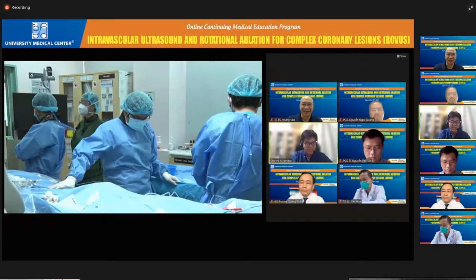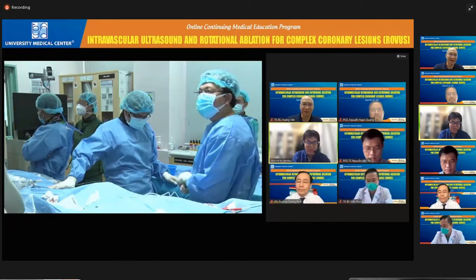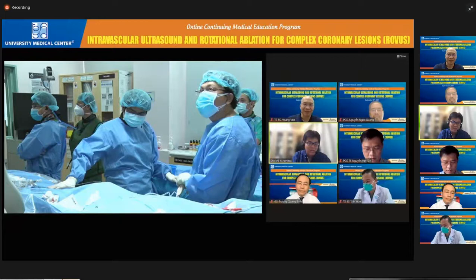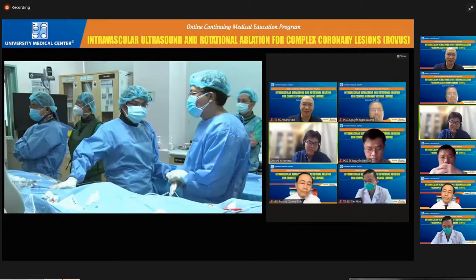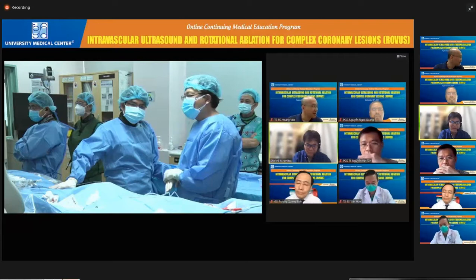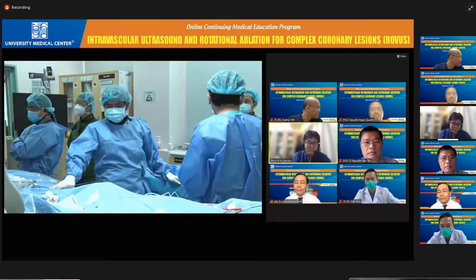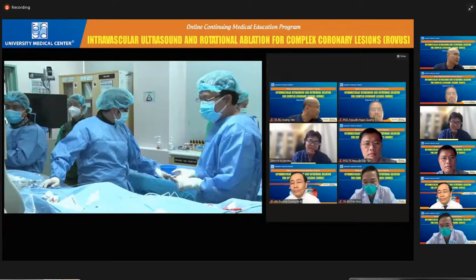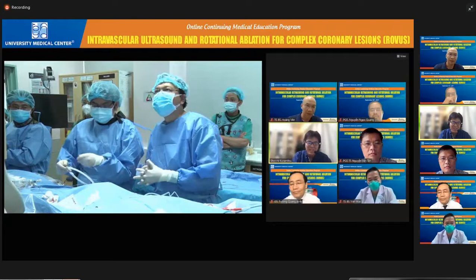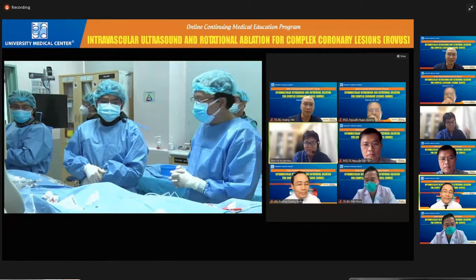The result is a little different from the China trial, the DK crush trial. However, I think this case is not a true bifurcation, according to the angiogram and the IVUS findings. That's why I think the provisional stent, I mean the one-stent strategy, is good enough for this patient. This is my opinion. Thank you.